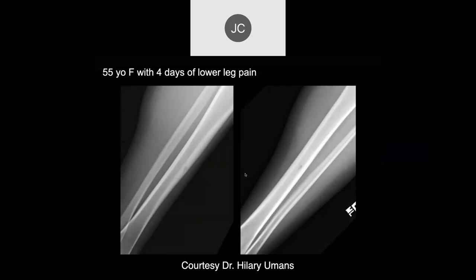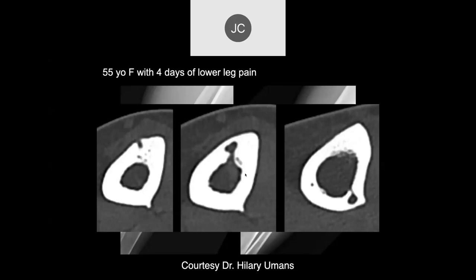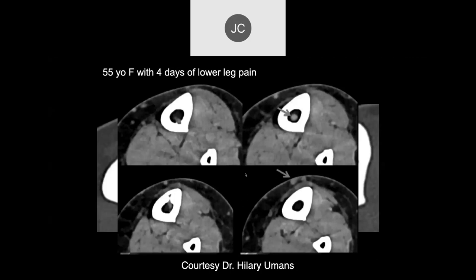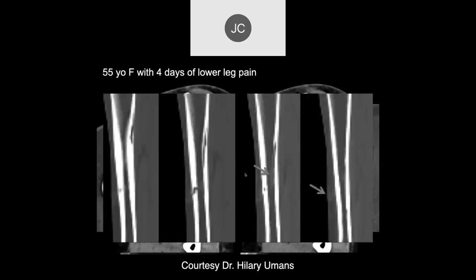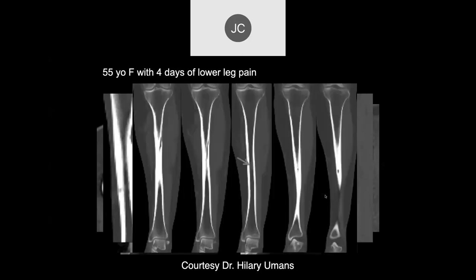What do you think of this case? A 55-year-old female with four days of lower leg pain. There's a little hole in the cortex — a lucency in the cortex. That's what the CT scan looks like. You can see a little bit of density in the soft tissues. This was just a little cortical abscess.